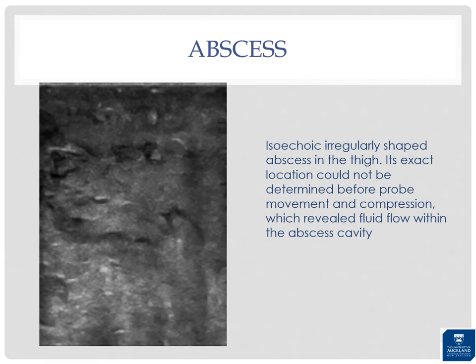An abscess may present as a soft tissue mass, typically with clinical signs of infection such as erythema, warmth, tenderness, and elevated white blood cell count. Ultrasound is effective in identifying extremity abscesses, especially superficial ones, though deep infections may require MRI. Abscesses most commonly appear hypoechoic and heterogeneous. A very purulent abscess may have numerous internal echoes and be isoechoic or slightly hyperechoic. Use transducer compression to see movement of debris and pus within the abscess.